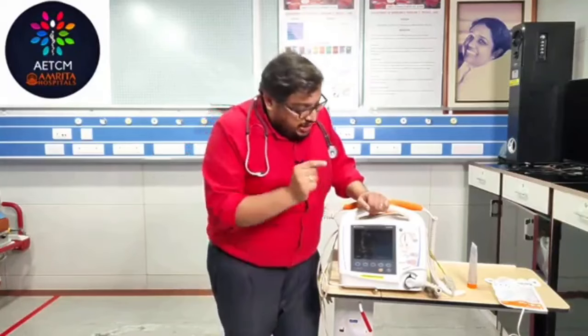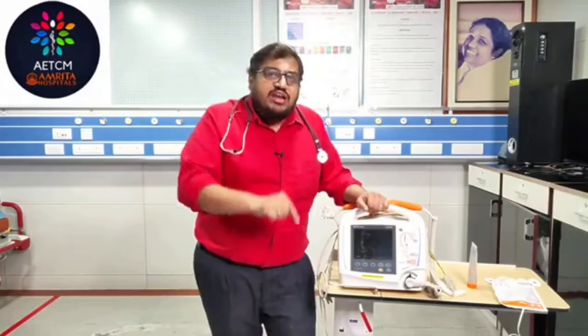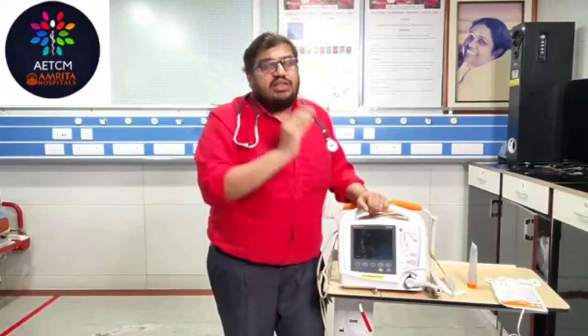So while you are delivering the shock for a cardioversion, you have to make sure that you are selecting the energy, and also in your defibrillator you have to select the synchronized button, press that synchronized button and deliver the shock. At the time of delivering the shock, you need to hold it for a fraction of a second more, maybe 1 or 2 seconds, because the machine needs to identify the peaking of the R wave, and the machine needs to deliver the shock at that point.